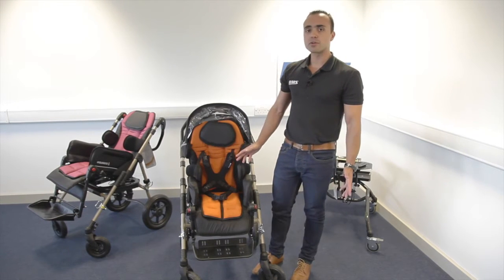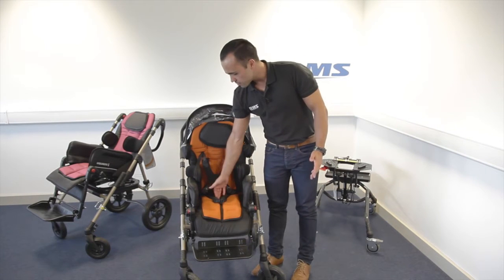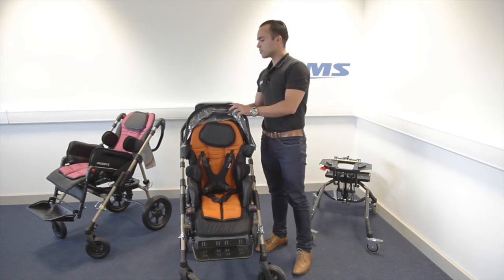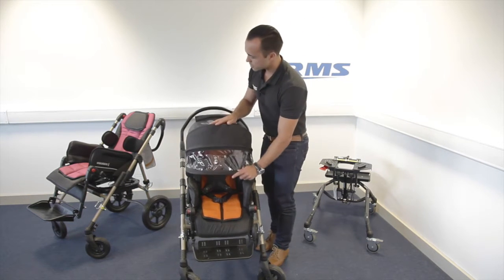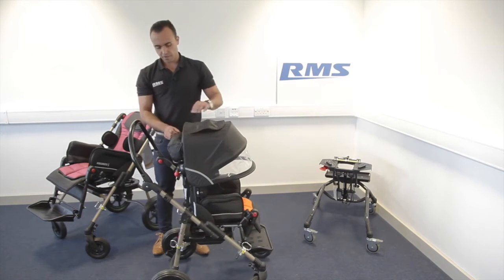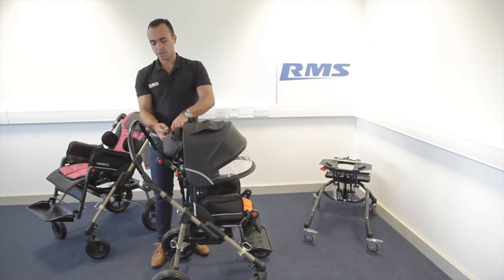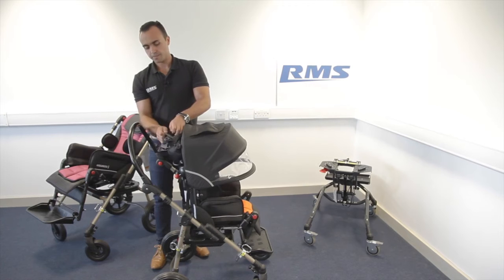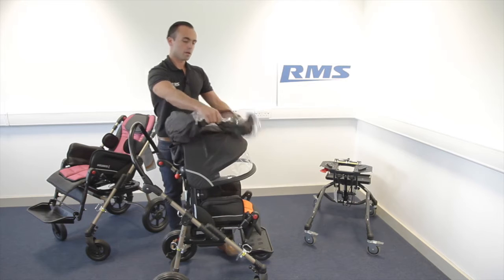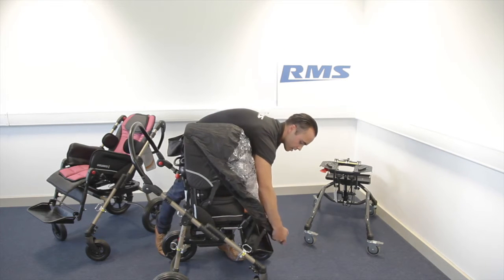There are a lot of accessories available: harness, belts, sun canopy, and a rain cover. The rain cover is stored in a bag, always attached to the buggy. You just need to remove it and it goes all the way down over the seat.